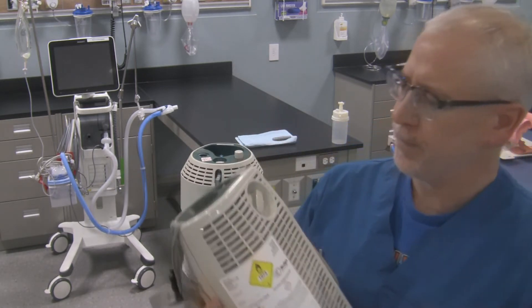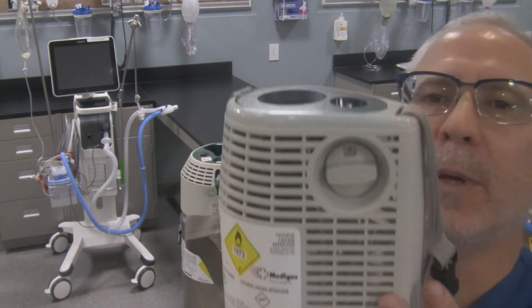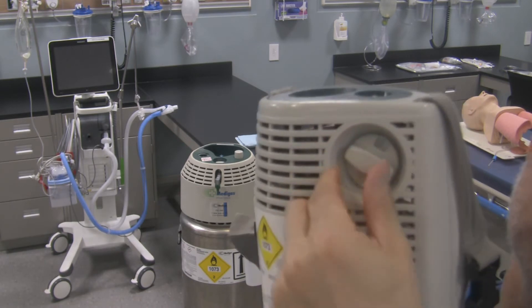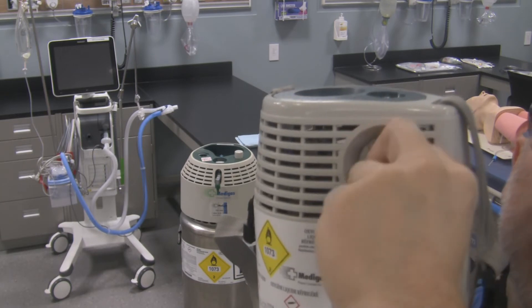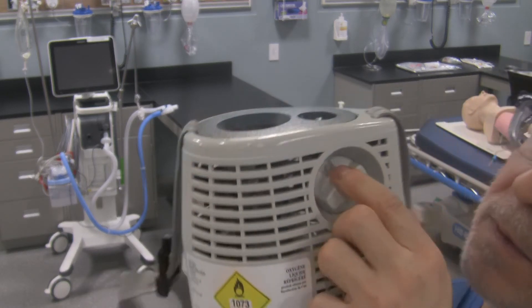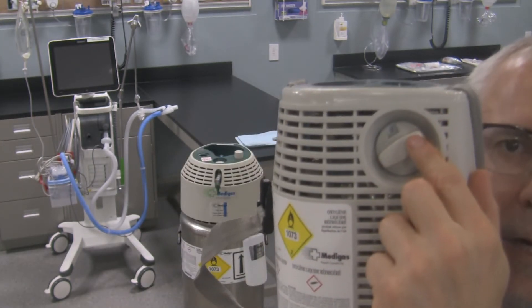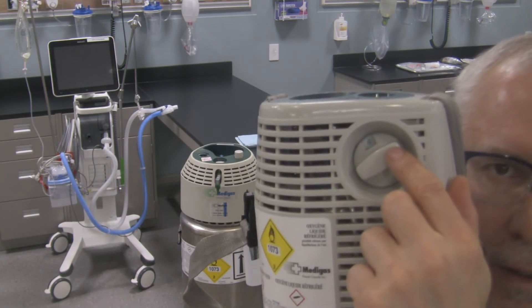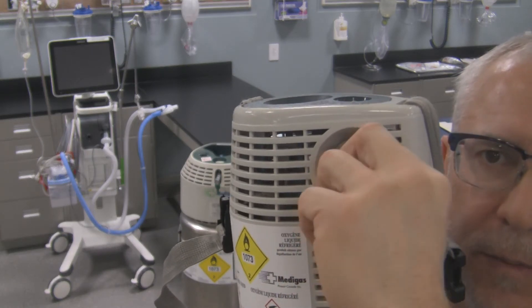There's a flow meter on the side of the portable as well — just like the reservoir, you can see it's pointed to zero. As you need a flow of oxygen, simply adjust it to the appropriate gas flow for your patient. This one only goes to six liters a minute, but you can get flow meters for these portable containers that go up to 15 liters a minute. Check what's available from the manufacturer and get it adjusted if needed for the patient.